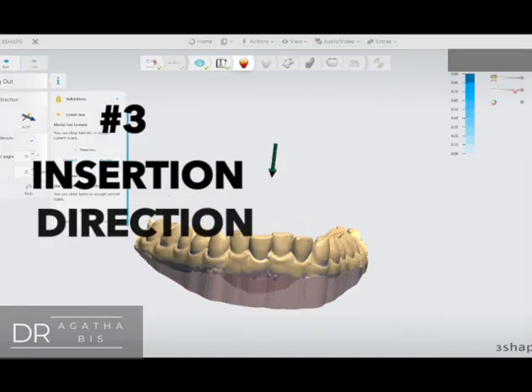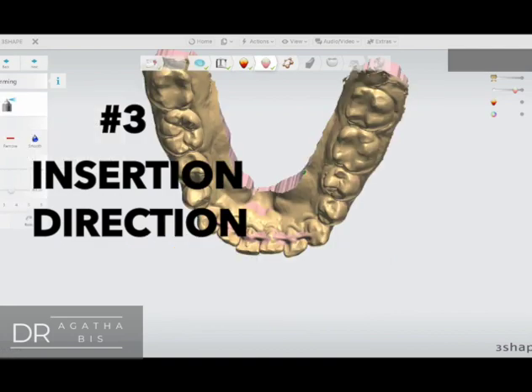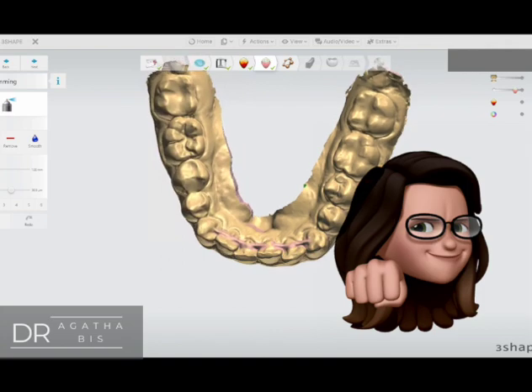Number three: insertion direction. I just leave it the way the software designs it, but sometimes I'll flip the model to make sure that the patient can get it out easily.